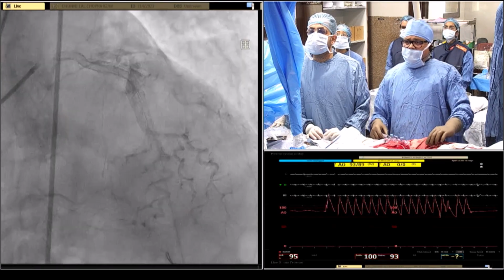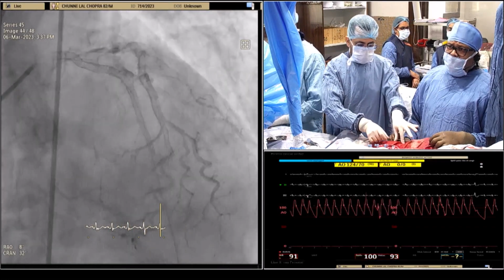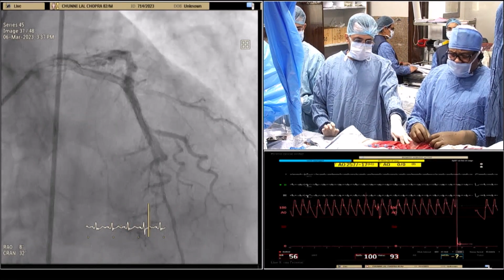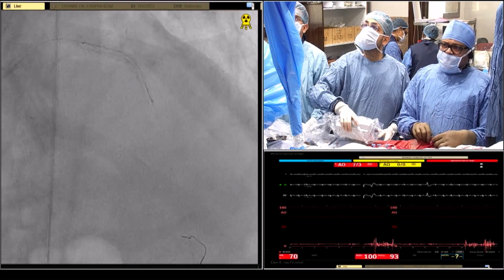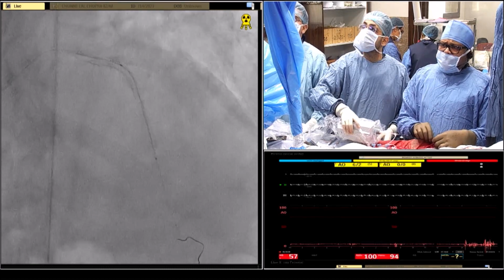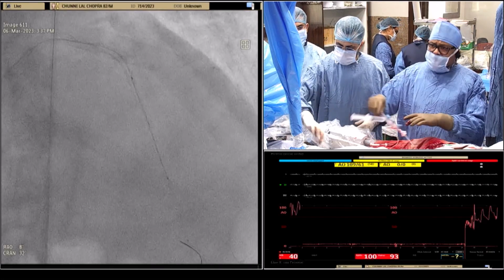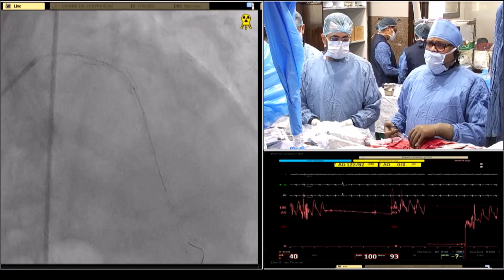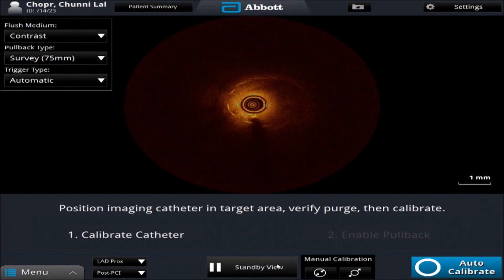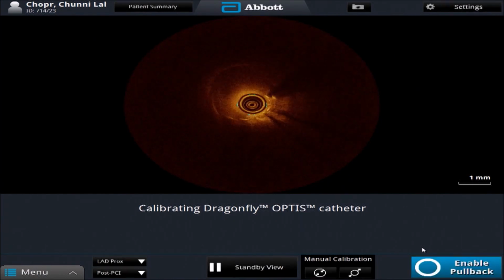See, the diagonal is flowing well. I personally feel we can leave this aneurysm at this moment of time and have a close follow-up to look for how it's going to progress. There is some difficulty in pushing the OCT catheter across the stented segment, but ultimately we are able to push it. And we are now distal to the distal LAD stented segment. Are we seeing good flow across the LAD? So a second run is required to complete the study, and let me have the second run proximal to the ostial LAD as well.